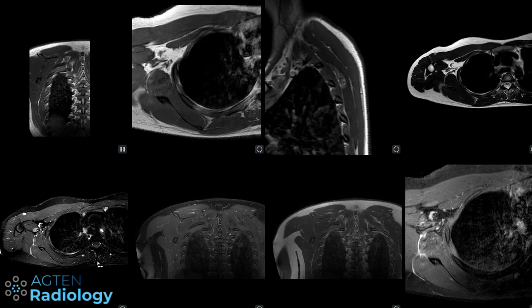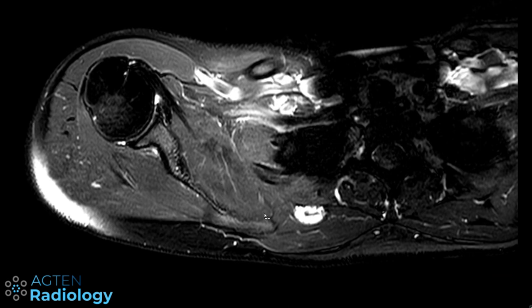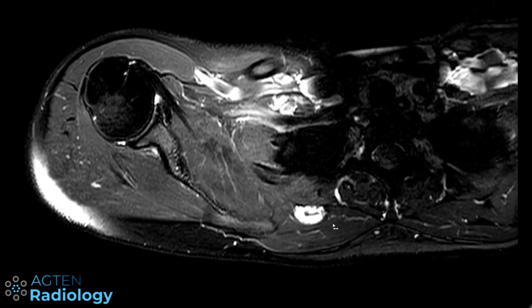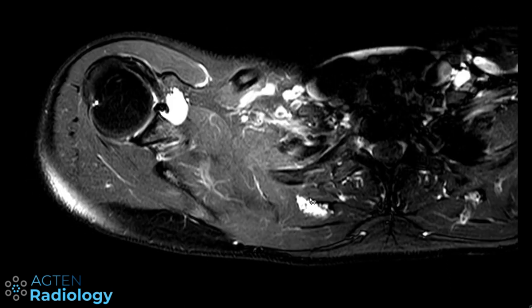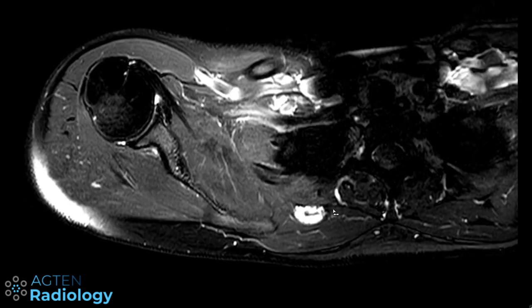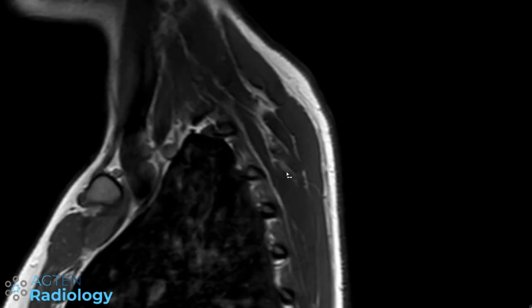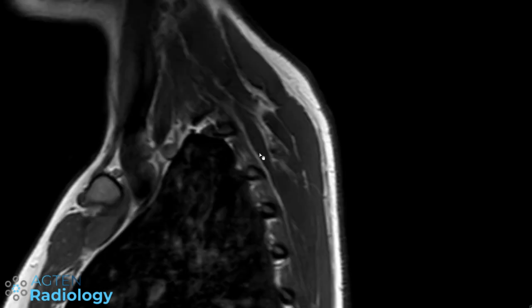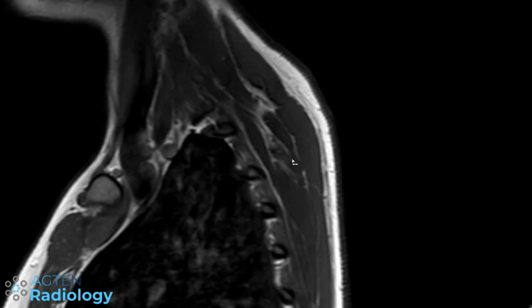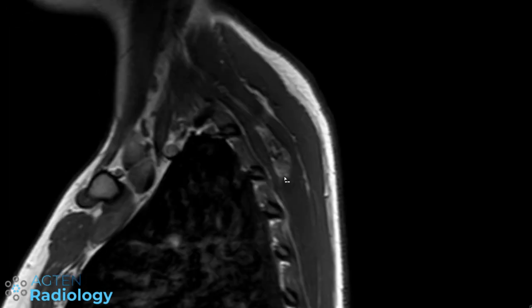She came back one month later with this MRI. On this axial T2 fat saturated sequence you can see this T2 hyperintense mass lying deep to the rhomboid muscles, just next to the superior posterior serratus muscle, medially to the scapula. That's basically the very typical location that these lesions can occur. If you look closely on this sagittal T1, you can see the serratus superior posterior and also the rhomboid muscles, and it's intermuscular — not intramuscular, but between the muscles. This is a very important point.